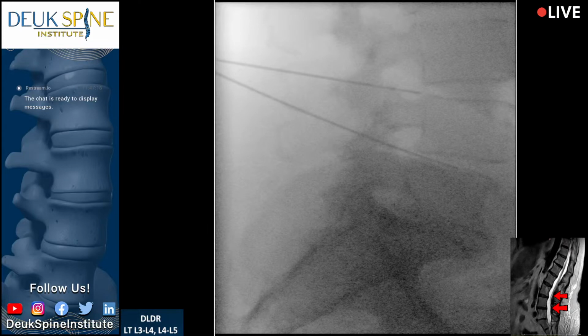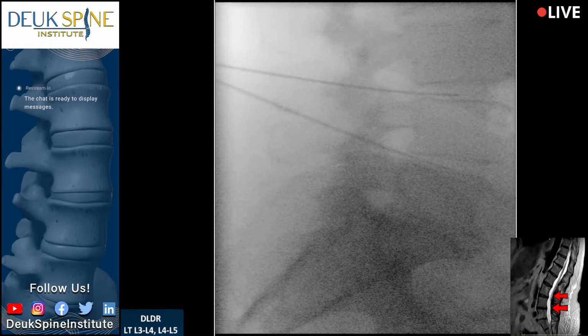It's always a little tricky whenever you're dealing with two discs, right? Because you got the two needles. Are you comfortable? Yes. All right. Did you hear that? Say it again. Yes. All right. Great. You're doing fantastic. We're going to put you to sleep in just a few minutes, all right? But I'm going to tell your story.